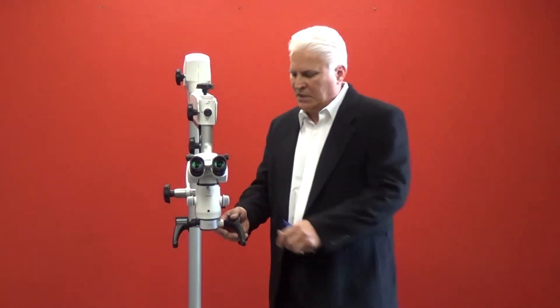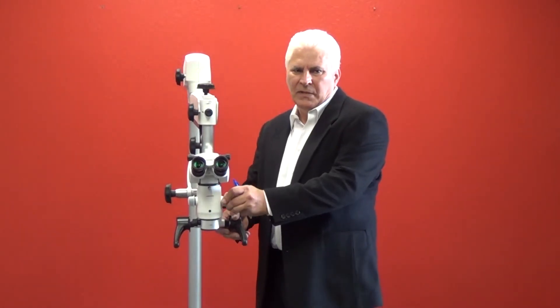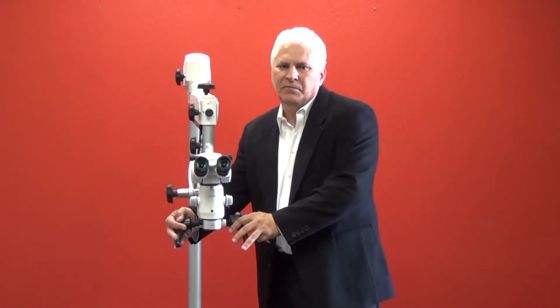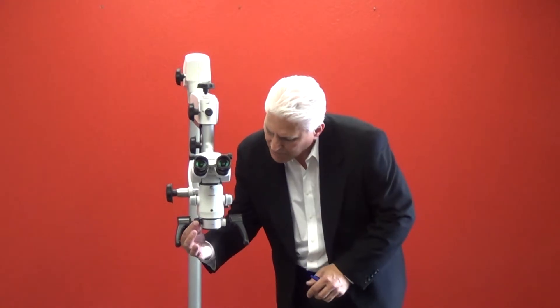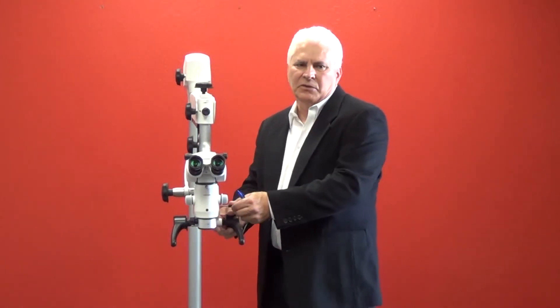Next we have a cluster of controls including the mag change knobs, ergonomic handles, fine focus, and a filter selector.